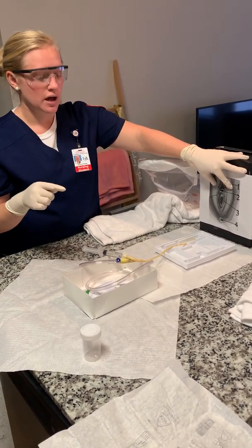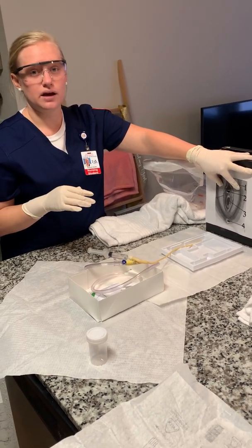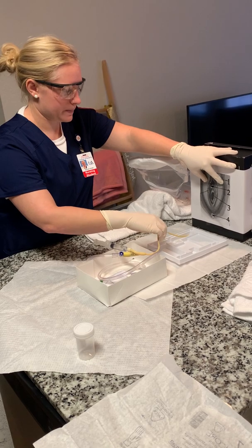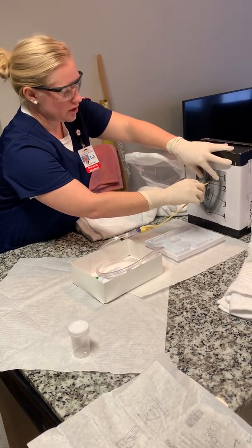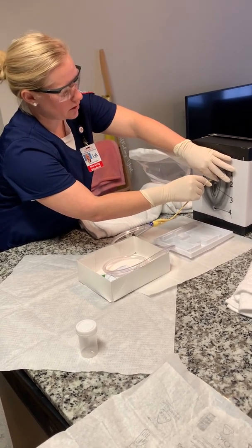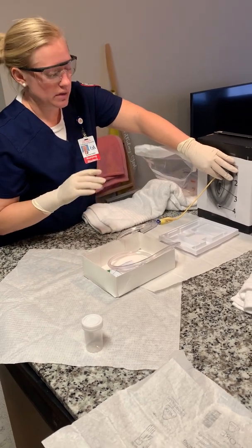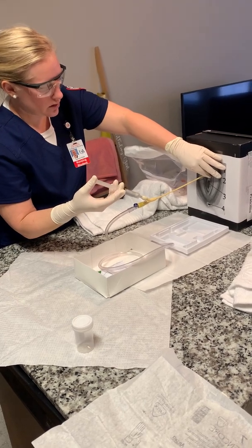So now I'm going to insert. I need to tell my patient to bear down or take a deep breath and exhale while I'm inserting. So I'm going to move this a little bit closer. Okay. So I'm going to insert until urine is returned, and then I'm going to insert 1 to 2 inches more on the female, and then for a male, I would insert until bifurcation. So now I'm going to inflate the balloon.